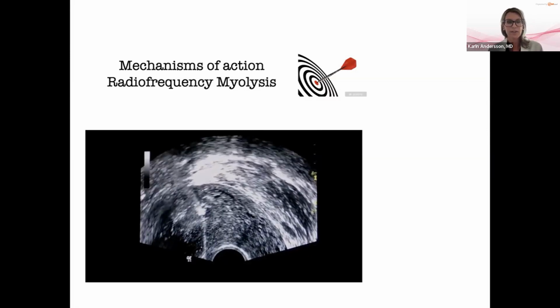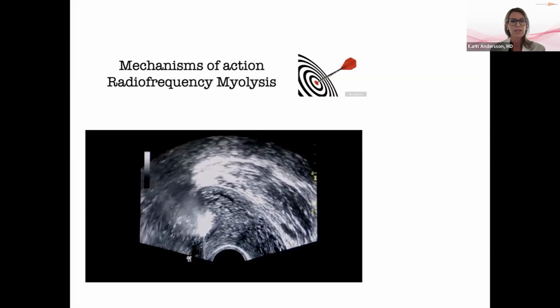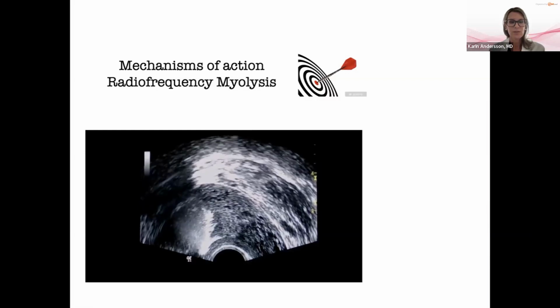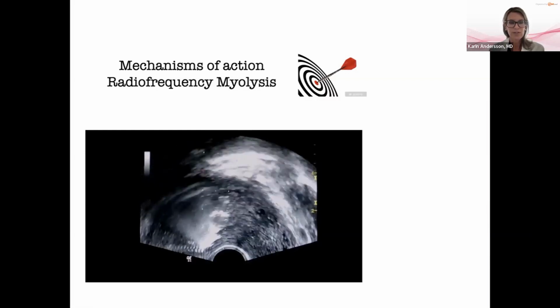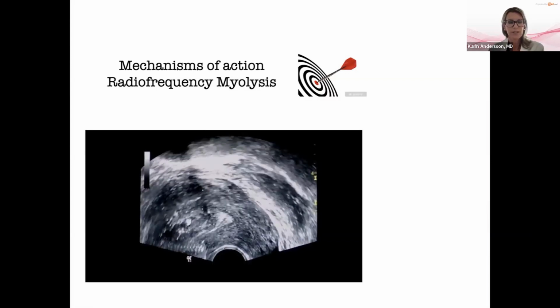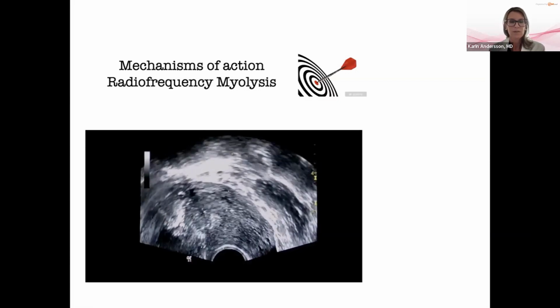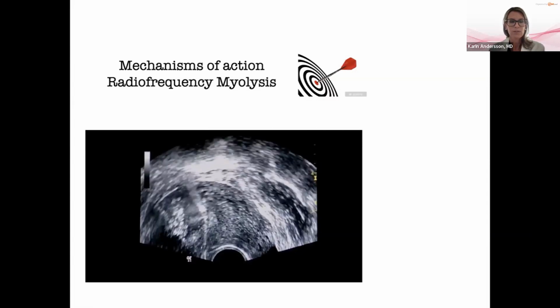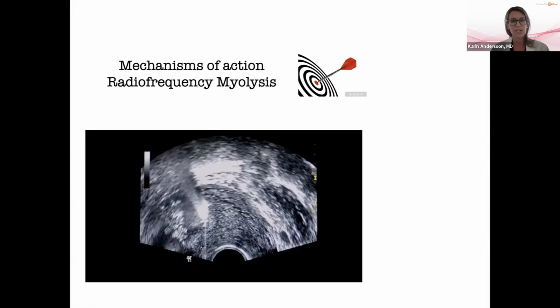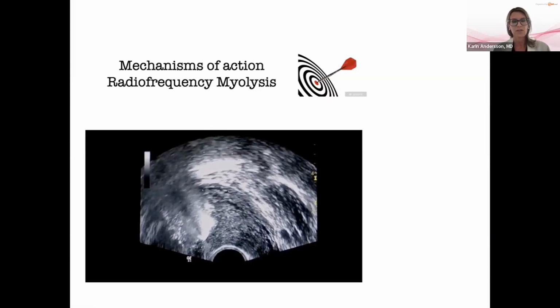Of course, we have a variable exposure, which is very nice. You can choose how much you want to expose the needle, independent of the fibroid size. So as you can see, these are quick insertions, and mean time for a 4-5 centimeter fibroid is less than 10 minutes. You can see this is the third insertion that we do in this fibroid. And the aim is to have about 70-80% of the fibroid treated by the ultrasound verification of the echogenicity.